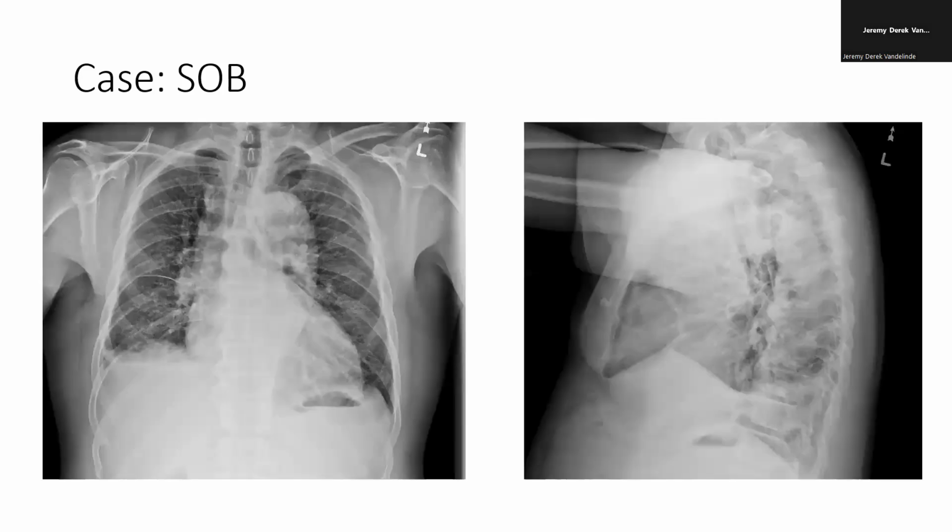Next, we get an evaluation of what his chest X-ray looks like, and as you can see, there's maybe a little bit of consolidation in the right lower lobe, as well as what looks to be a pleural effusion. So clinically, you can assess that this is likely a community-acquired pneumonia, and the natural course would be antibiotics and, as he improves clinically, looking towards discharge and outpatient follow-up.